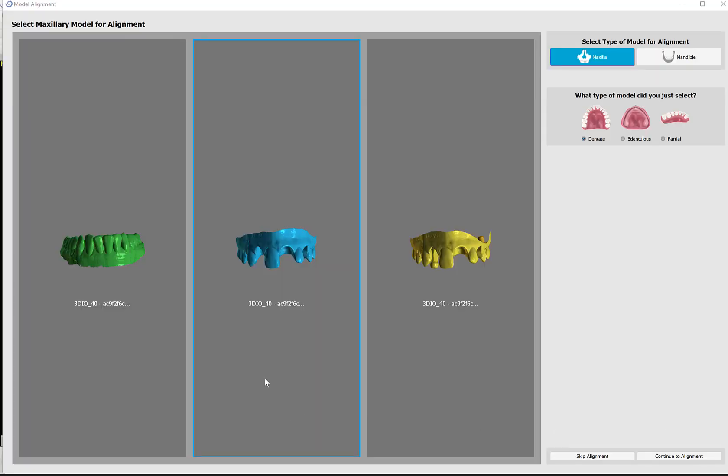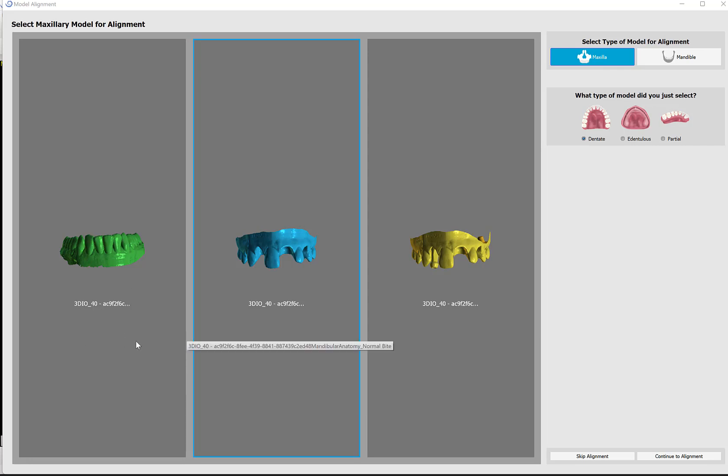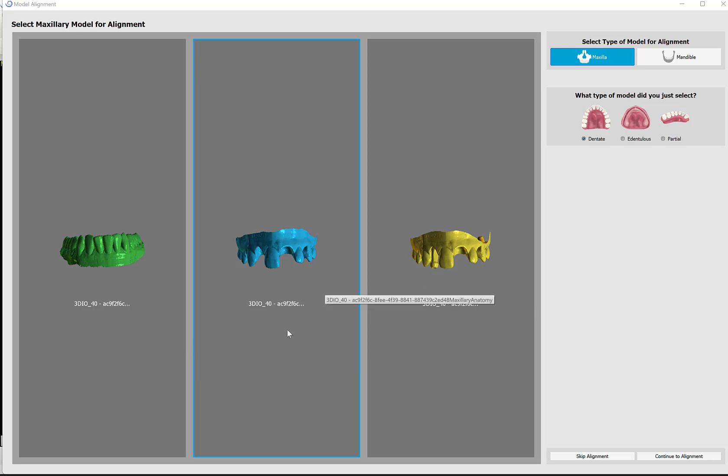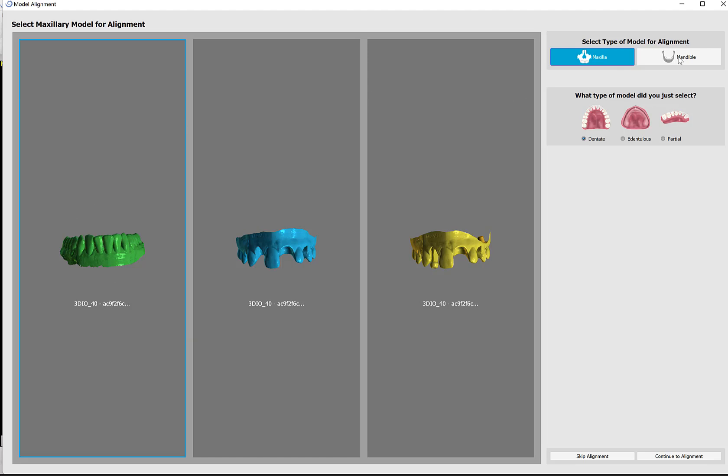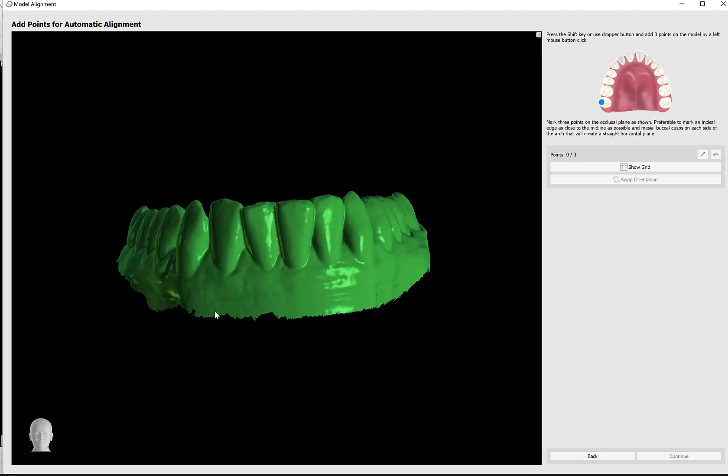We are now brought to our model alignment screen. We see the files that we've imported. Generally, the recommendation is to select the model on which the restoration is going to be planned. Because we're missing a large amount of teeth here, I'm going to select the opposing arch. I'm going to select the relevant model by left-clicking, then click on the relevant options here for mandible, dentate, and then continue to alignments.